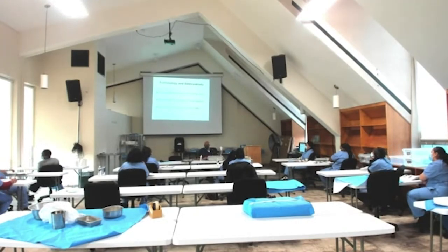You'll have several counts. The OR count, the CCS count. Make sure when you put the count next to it, if it's manual, if it asks for six Alices, you write six. Don't check anything off, because if you're checking it off, you're saying that it's all there, right, Terrell? And even though it's asking for six, you might only be putting four in the tray. So under comments, you'll say minus two. The other important thing about your count sheet, before you start it, read it, and if it's an automated system, then your count sheet is going to appear on the screen.